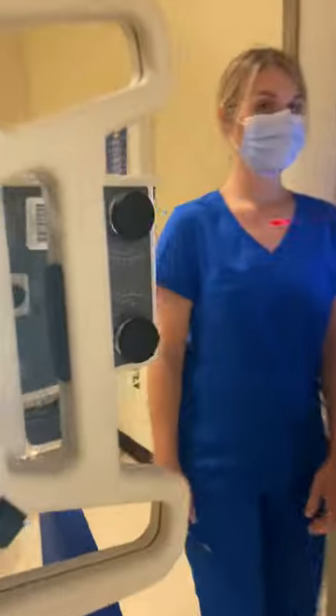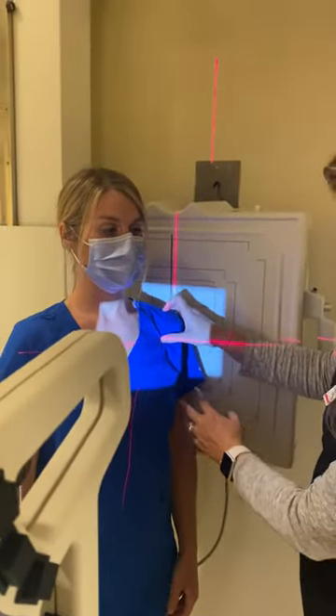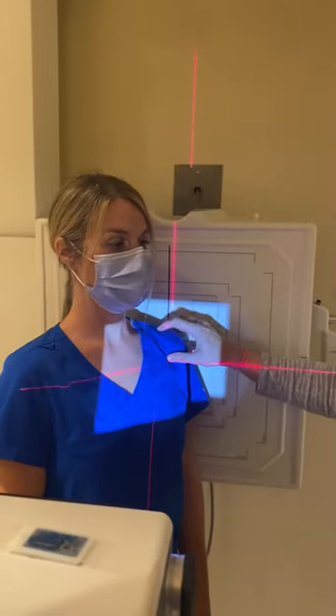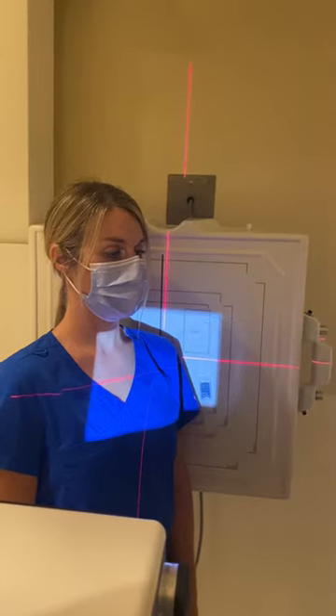Place the patient in front of the wall bucky. Our centering for the AP oblique shoulder is 2 inches medial and 2 inches inferior to the superolateral border of the shoulder, which puts us in the glenoid cavity.